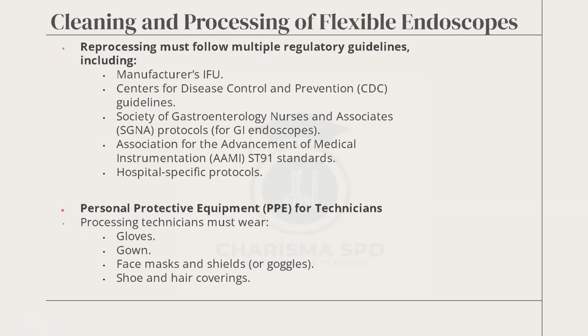And the PPE is there: gown, gloves, facial shield, mask, shoe covers, and hair covering. And when you go to work in decontam and you get home, please don't hug anybody. Go take a good shower before you hug somebody in the house. Next slide.